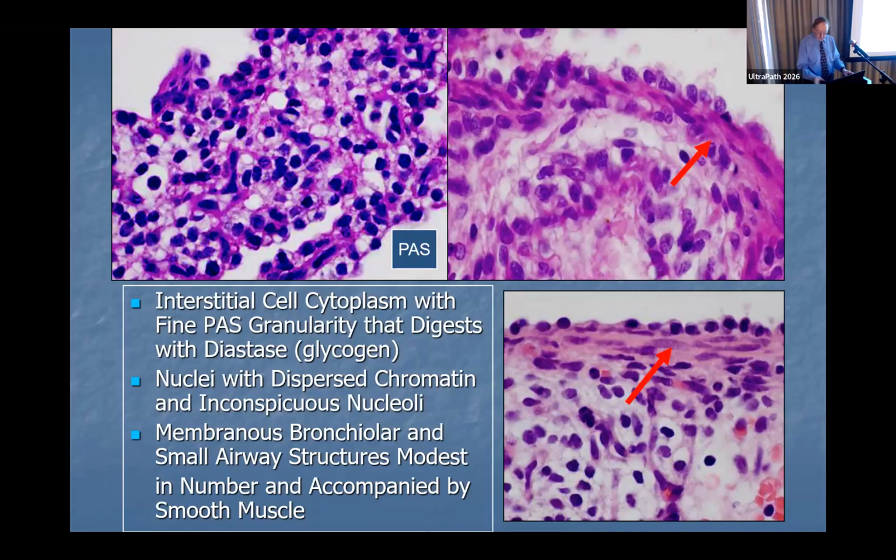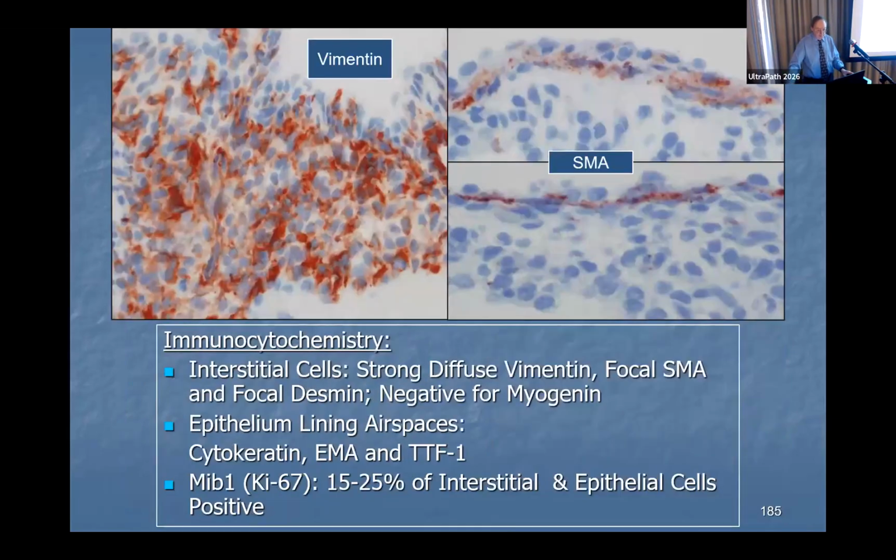And if you go on in the pleuropulmonary blastoma and look at the solid component, you can have any type of sarcoma that you wish to look at. You can have things that look like pleomorphic sarcoma. You can have areas that look like synovial sarcoma. You can have areas that look like chondrosarcoma and various sort of mesenchymal-derived type of cells. Vimentin, again, also here, the SMA just highlights sort of those myofibroblastic cells that are next to the epithelial lining.